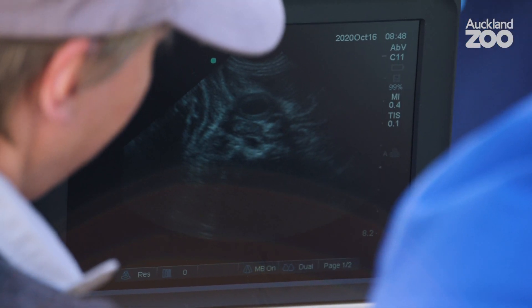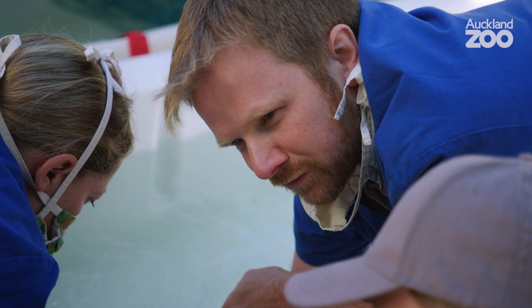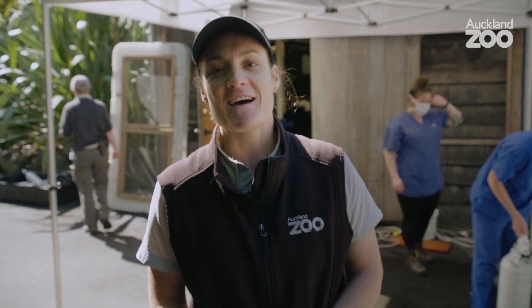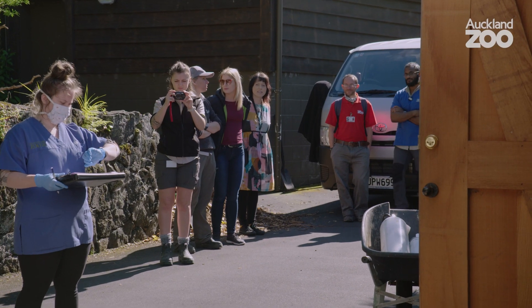That's the heart — you can see the heart moving and contracting in the middle of the screen. We had quite a crowd today; a few keepers came in who might not normally be working with the eel, but it's one of those things — it's always really interesting when something's being done for the first time.